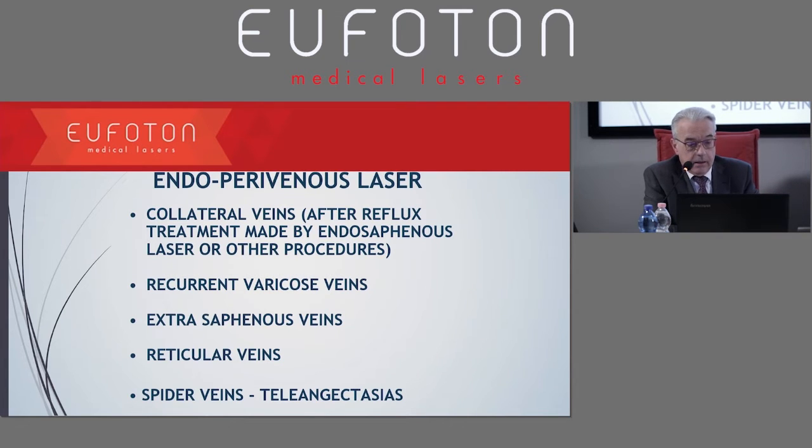Extrasaphenous veins, reticular vein, and spider veins, telangiectasias. With this technique, we can treat all the problems. Apart from the great saphenous vein or the small saphenous veins, we can treat all of the problems of the lower limb.